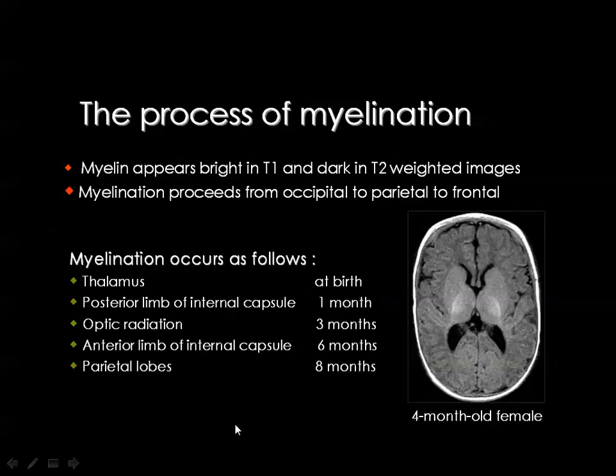Then if you know that water is black in the T1 and bright in the T2, while fat is the opposite.